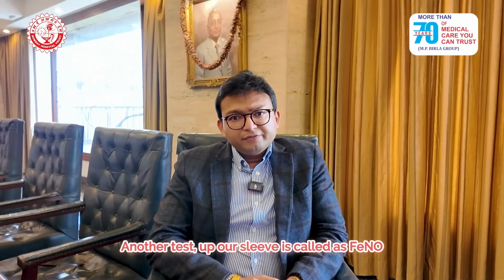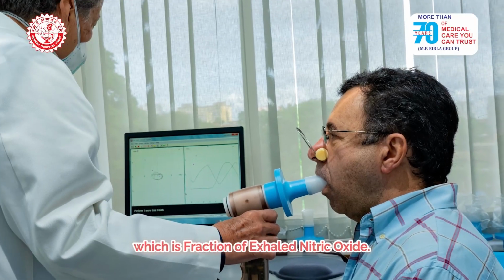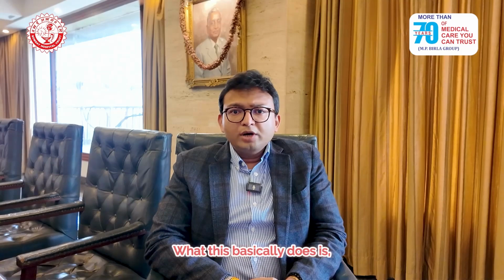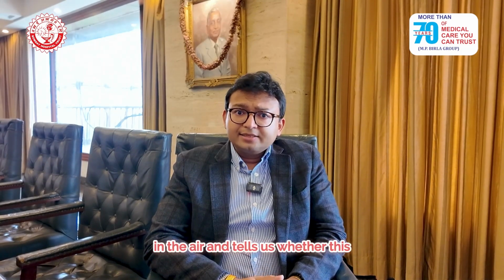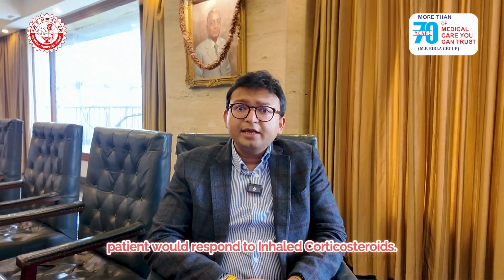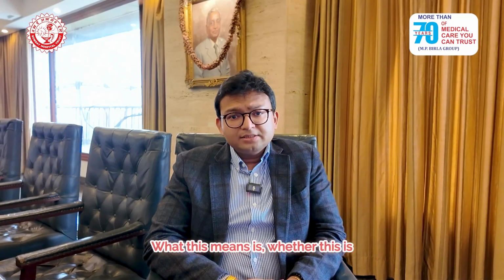Another test up our sleeve is called FeNO, which is fraction of exhaled nitric oxide. What this basically does is it measures the nitric oxide exhaled in the air and tells us whether this patient would respond to inhaled corticosteroids. What this means is whether this is a type 2 inflammatory response or not.